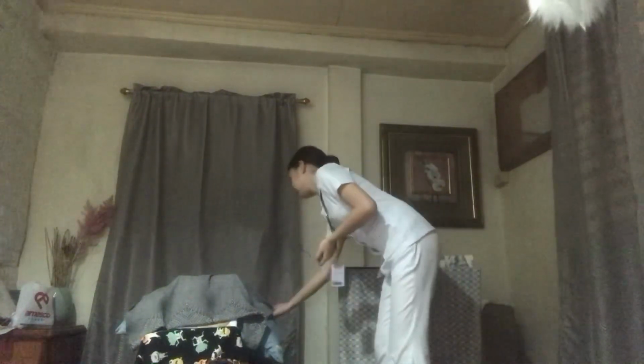So, good morning, ma'am. I'm Michael Guevara, your student nurse for today. May I know your name, your age, and your birthday? So, ma'am, today I will do the catheterization, which means that I will be exposing the private area. Is it okay, ma'am? Also, I will insert the catheter, ma'am, for you to be able to release the urine.